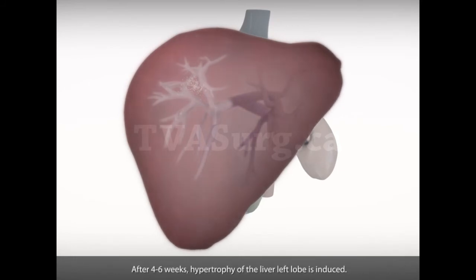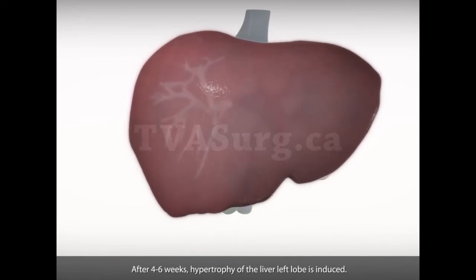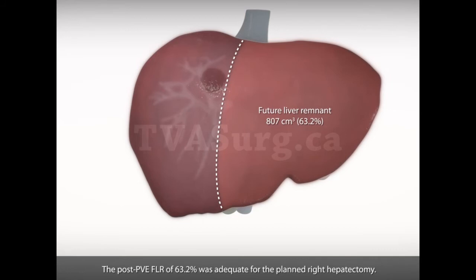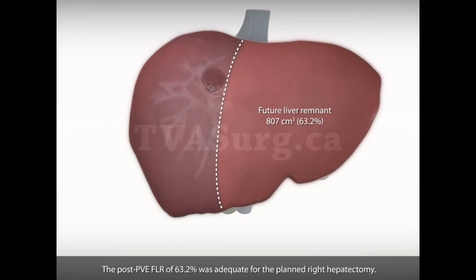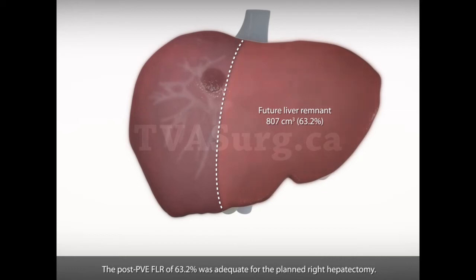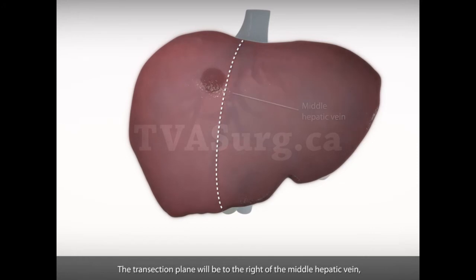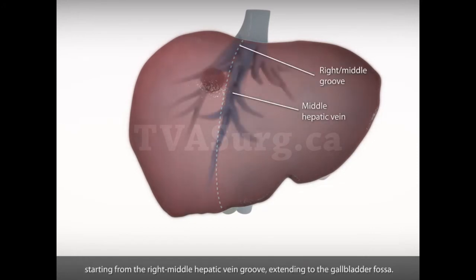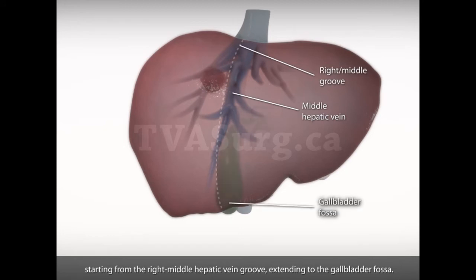After 4 to 6 weeks, hypertrophy of the liver left lobe is induced. The post-PVE FLR of 63.2% was adequate for the planned right hepatectomy. The transection plane will be to the right of the middle hepatic vein, starting from the right middle hepatic vein groove, extending to the gallbladder fossa.